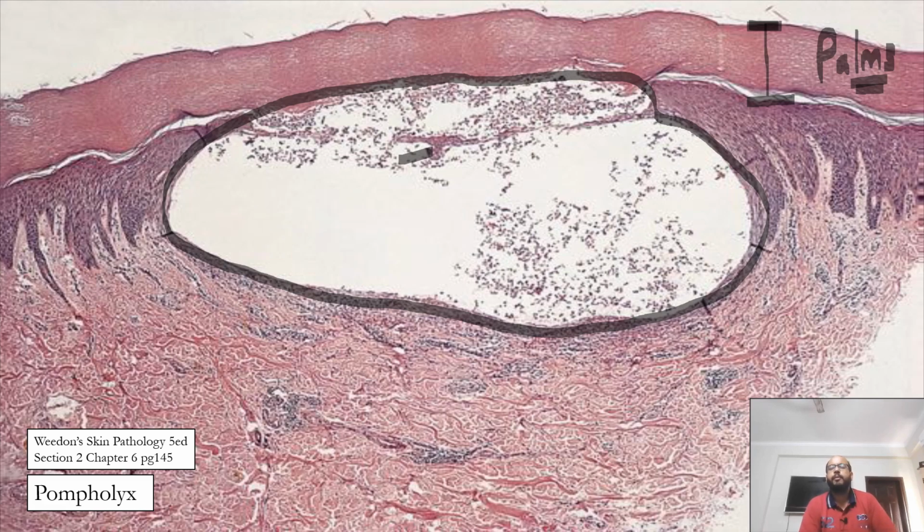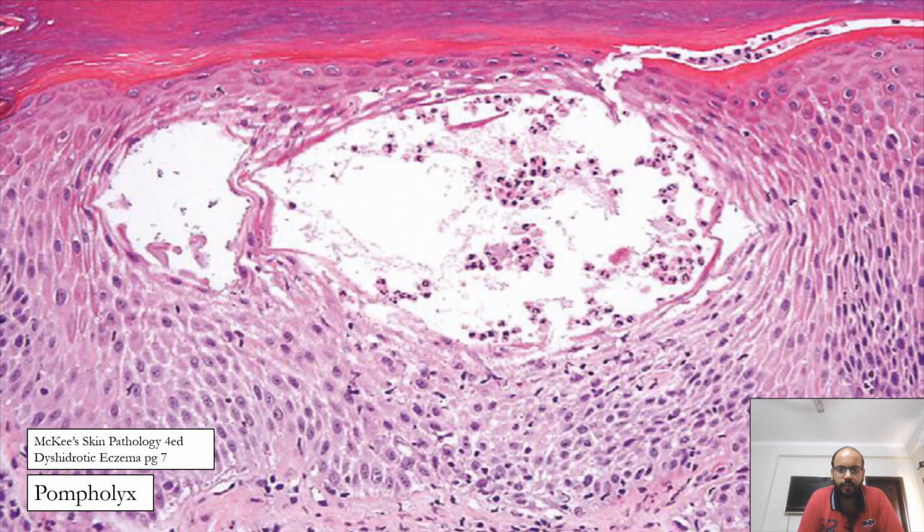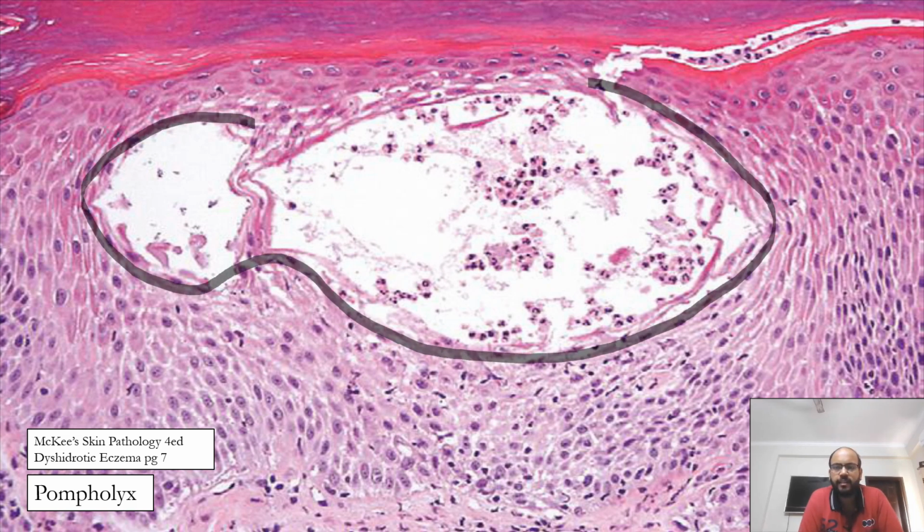The keratinocytes are not able to collect as much keratohyaline granules to form that kind of basophilic structure that we usually associate with epidermis. It is more of a pallor. And that pallor is also increased by intraepidermal edema. That is what is happening in spongiosis. There is edema, and because of edema, it looks a more diluted, shaded, less contrast picture. That is only because of pallor of keratinocytes and edema. So that is what we see in atopic dermatitis at the level of epidermis. A lot more is going on at the level of dermis. So we will not discuss them because atopic dermatitis itself will require a good amount of discussion on the biopsies. Just understand that you will see more of a lymphocytic and eosinophilic predominant spongiotic vesicle. Let's move forward.